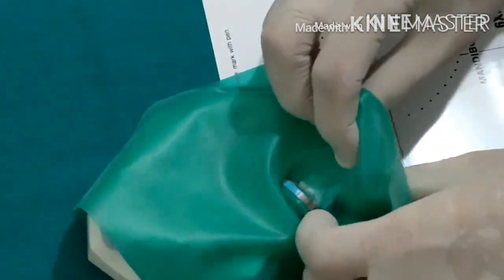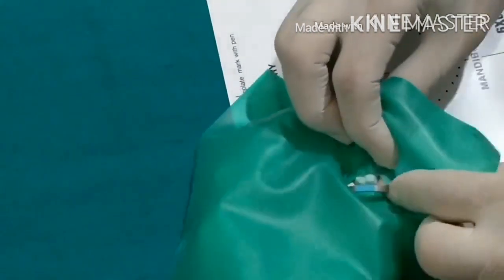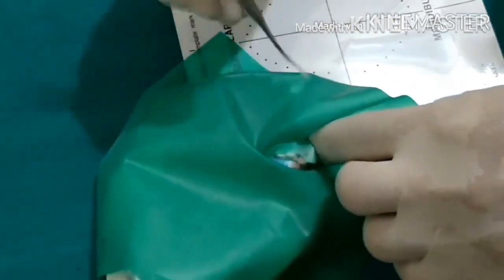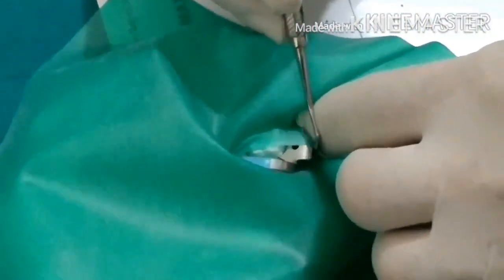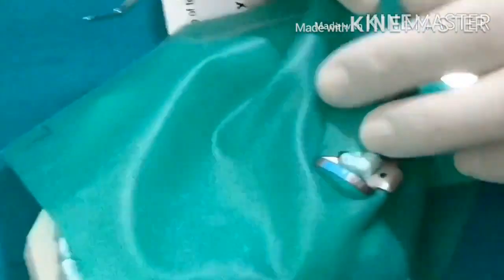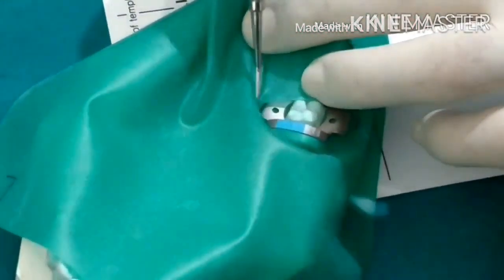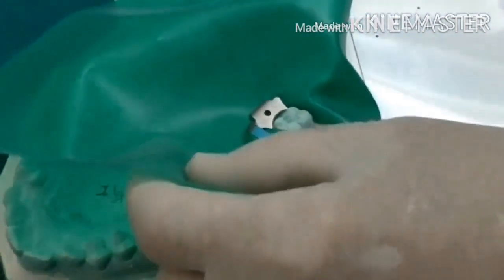There are two ways to seat the rubber dam around the tooth. On the buccal side you can just slip it down like this, or if it doesn't come easily, hold it and take a plastic instrument to extend it over. Similarly, on the lingual side just pull it, and you will see the hole come through. Pick it up and pull it down — now it's all done.